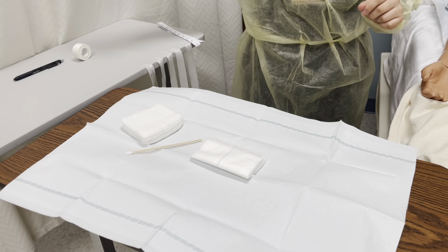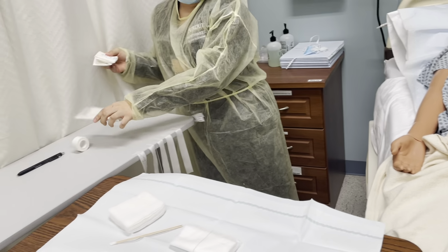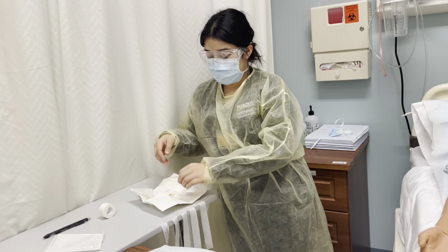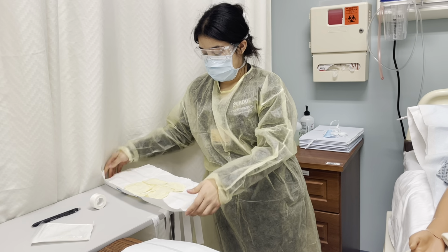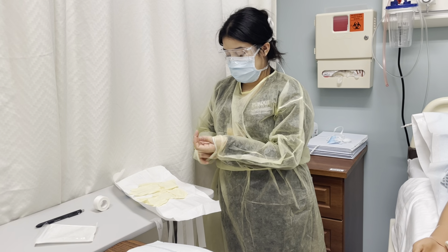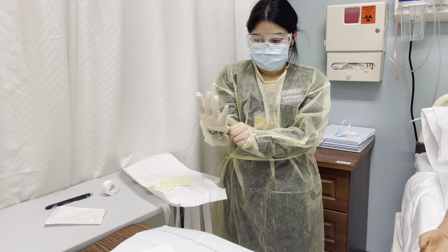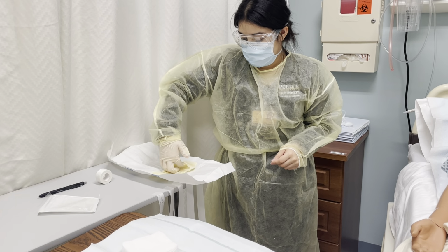Okay, now I'm going to go ahead and grab my sterile gloves. Making sure I don't give my back to the wound or to the sterile field, I'm going to place my sterile gloves on. Starting with my dominant hand, I'm going to place my glove on. And then placing my non-dominant hand glove on.